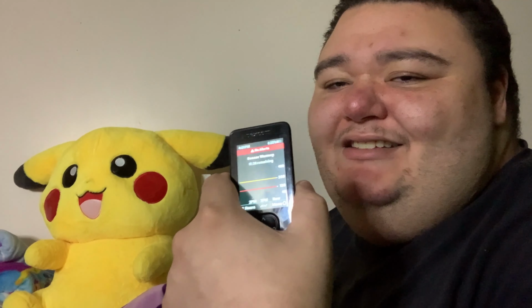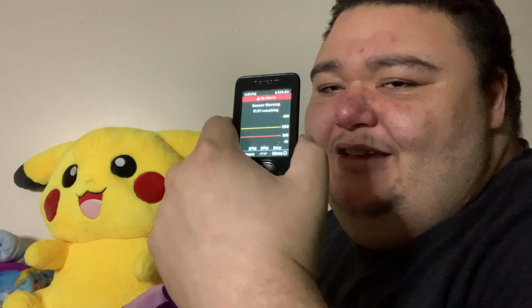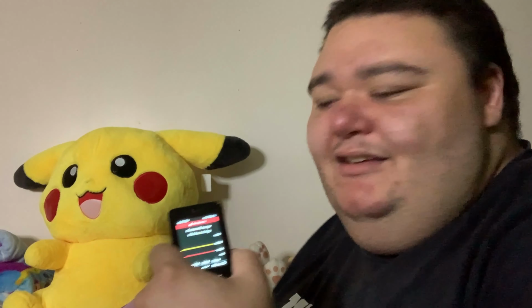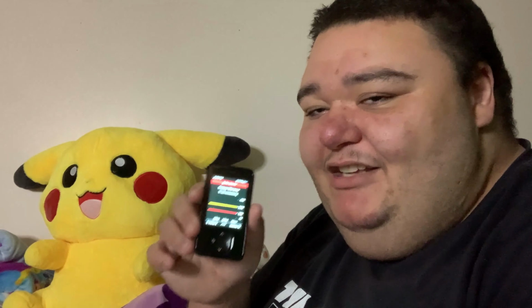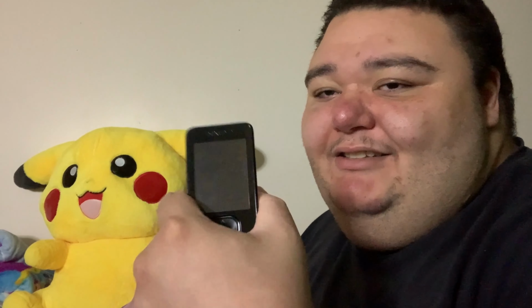Once the sensor warms up and the receiver receives the Bluetooth from both devices, it should be able to read. Sometimes I calibrate this, but I don't calibrate it that much. Maybe one time and that's it, as long as the number is not higher than 300. So I have to figure that out for myself. I'm going to let that sensor warm up and I'll be right back, and hopefully I'll give you guys an update.